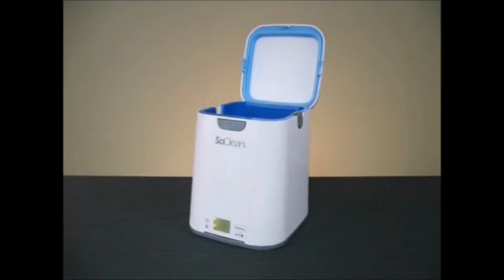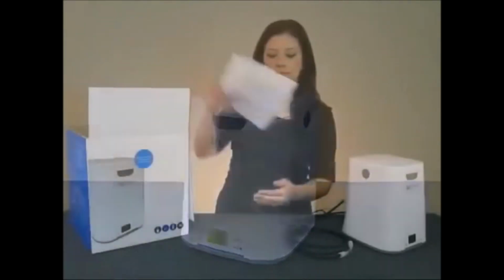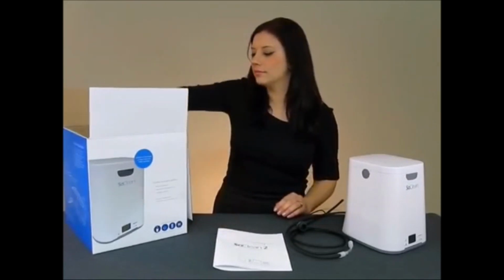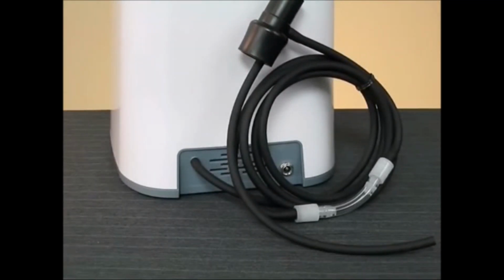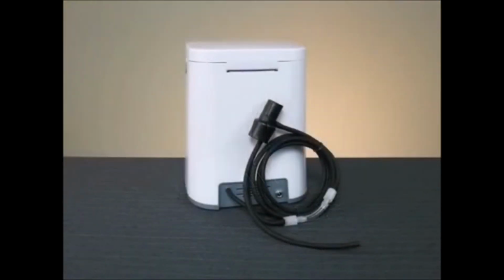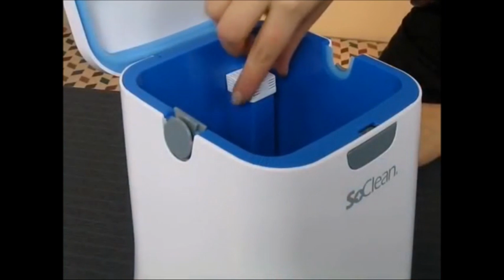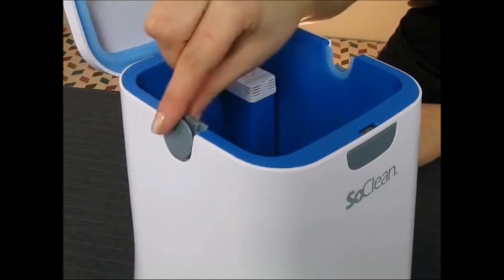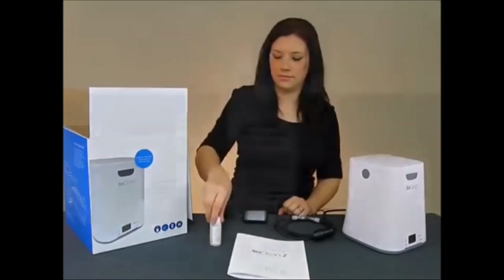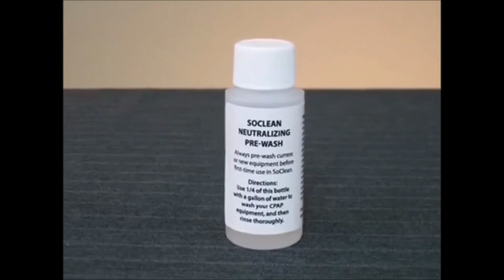Let's start off by getting familiar with the box contents. Along with the main SoClean unit, you'll find a user guide, power adapter, and an injection fitting connected to the SoClean by a length of hose. Along this hose, you'll see a check valve assembly. Installed inside your SoClean are a filter cartridge and a hose slot plug. Finally, included among these other items is a bottle of neutralizing pre-wash. The next step will show you just how to use it.